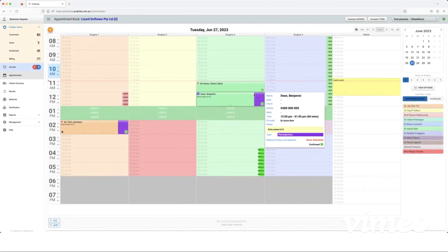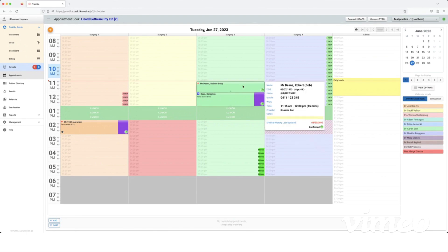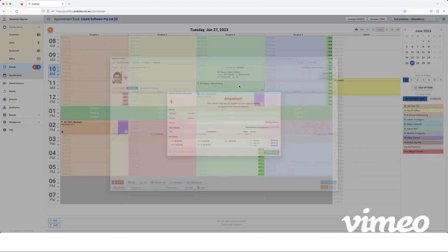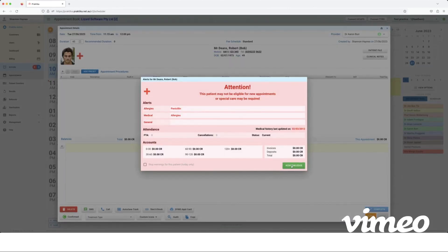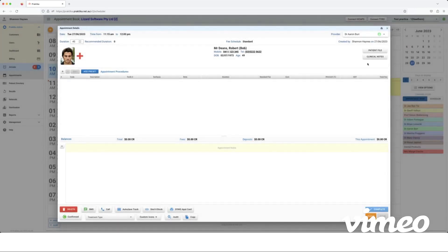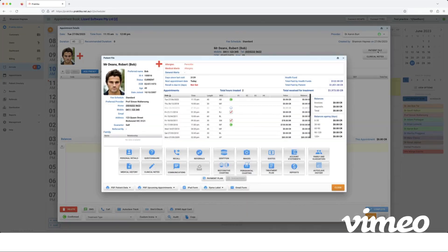Okay, I'm going to take you through our perio charting module on Practica. To get there we'll click on the appointment and go to the patient file and go to periodontal charting here.